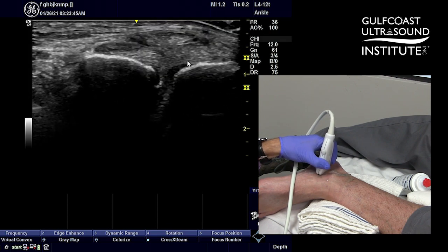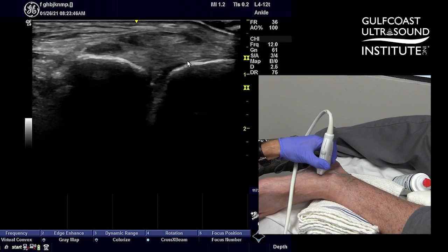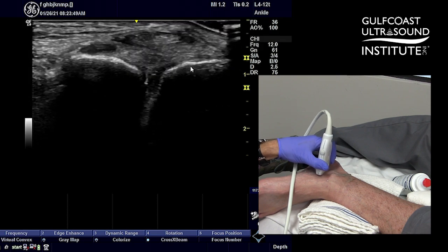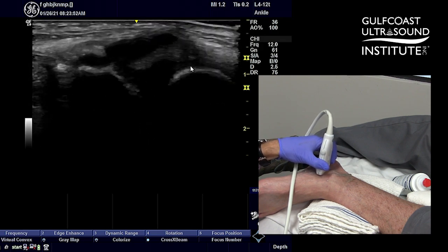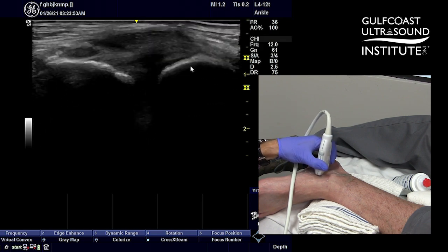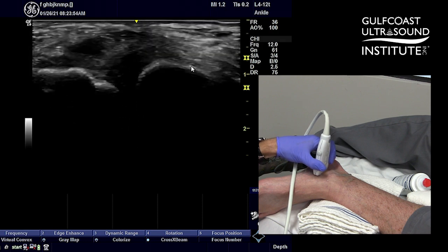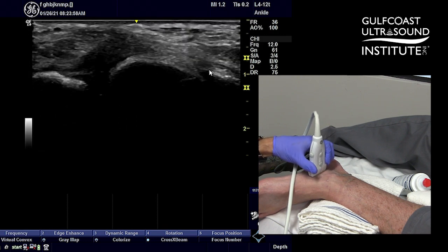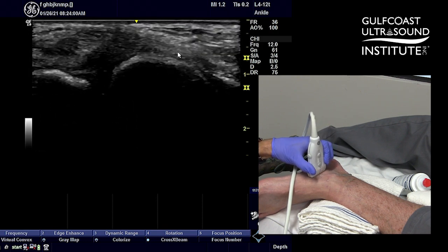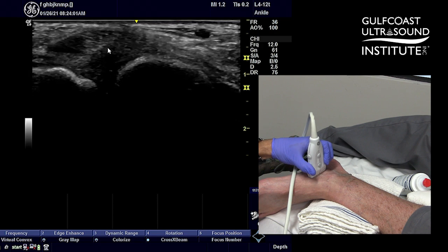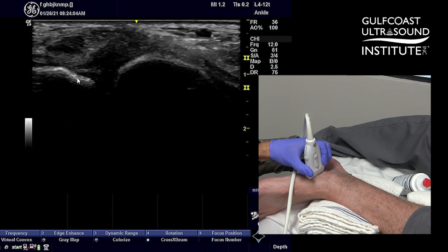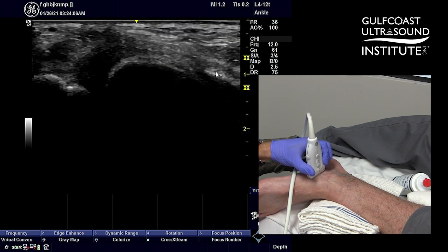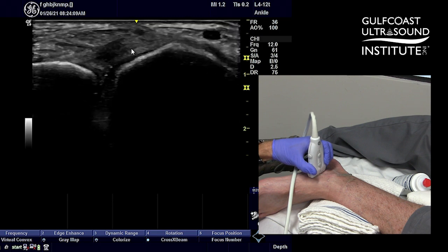If we follow this hyperechoic linear structure over the head of the talus demonstrated here by the arrow, and we slide a little bit distally, you can actually see the insertion of the spring ligament onto the navicular. So this is all spring ligament, with the posterior tibialis sitting over top, and then the spring ligament inserting onto the navicular.